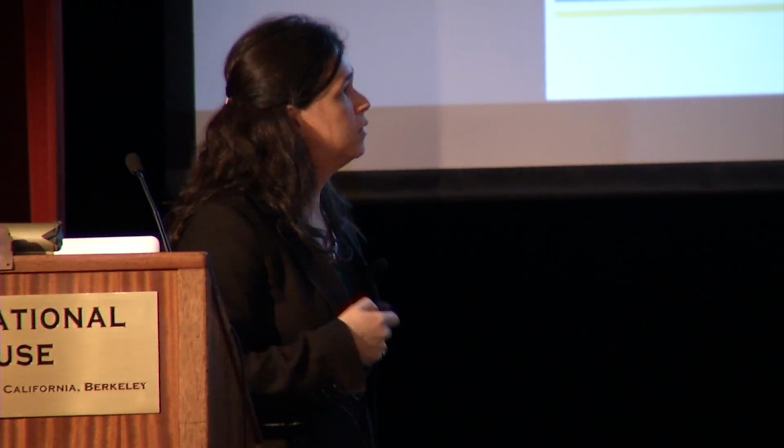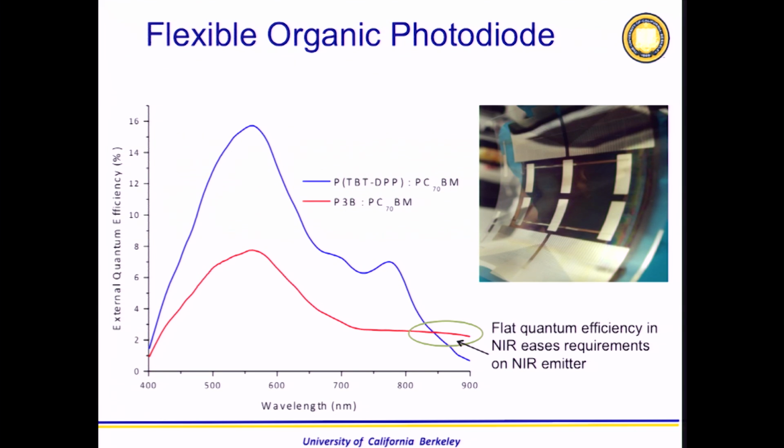We also developed the photodiodes that are flexible when printed. You can see here, I like to show the efficiency. The efficiency is not as high as you would have for a solar cell, for example, or even for a silicon photodiode. But that doesn't matter. What is important for this application is that the broad absorption of these materials allow me to do the measurement in different wavelengths and pick up all these ratios that I need in order to do this type of measurement.